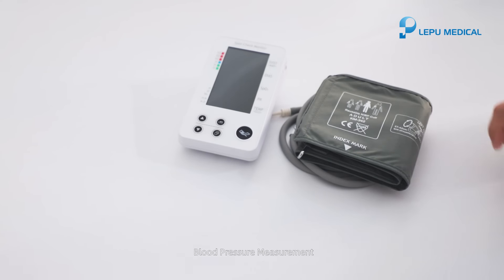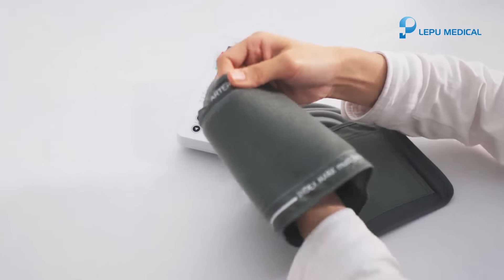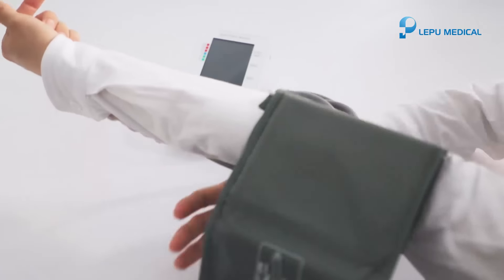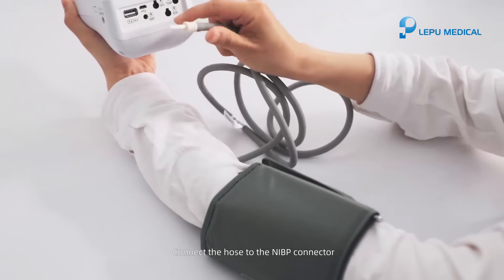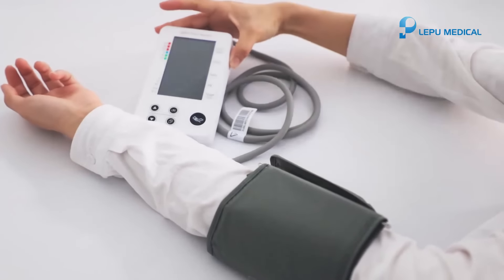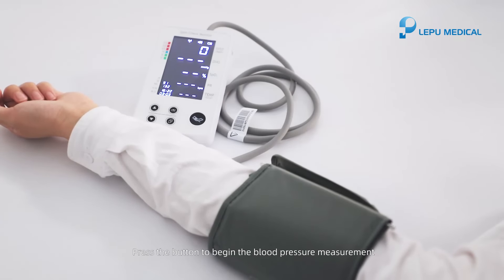Blood pressure measurement. Apply the cuff and wrap it around the upper arm evenly to the appropriate tightness. Connect the hose to the NIBP connector. Press the button to begin the blood pressure measurement.